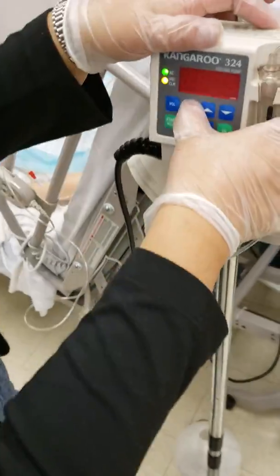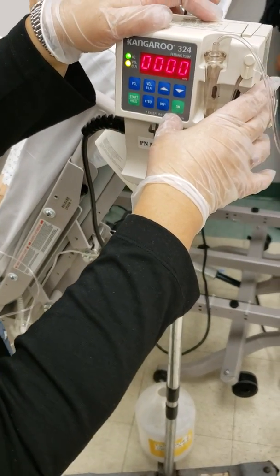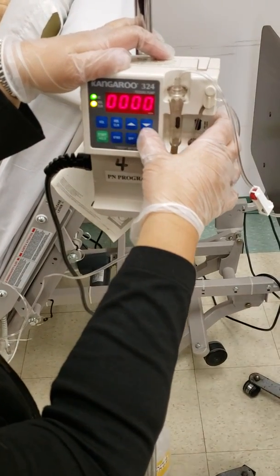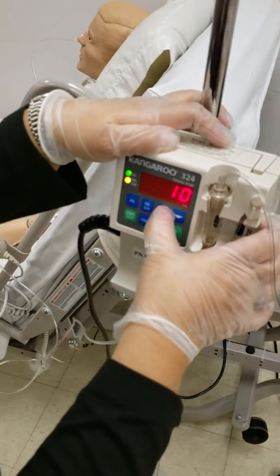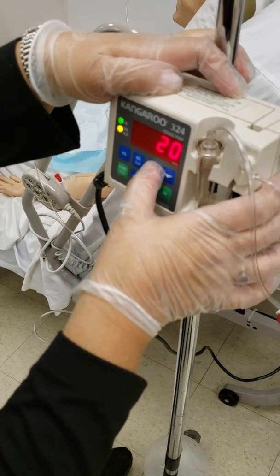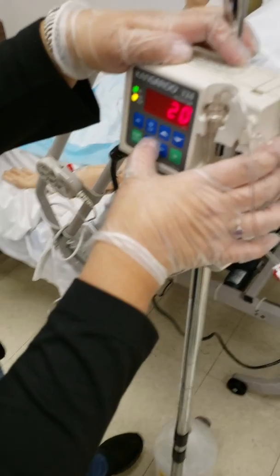Here the volume. Oh, that's good. It's better? Yeah. All right, volume. It's only 10. Thank you. Oh, it's going up. Oh, I know it should work. Oh, so I guess low battery. Low bat. Volume.